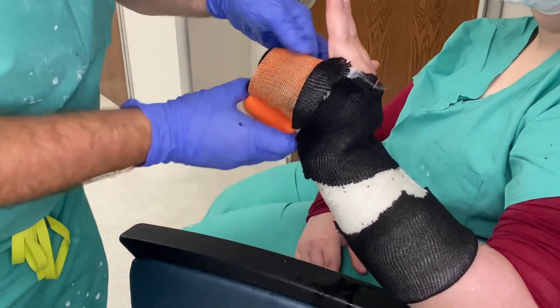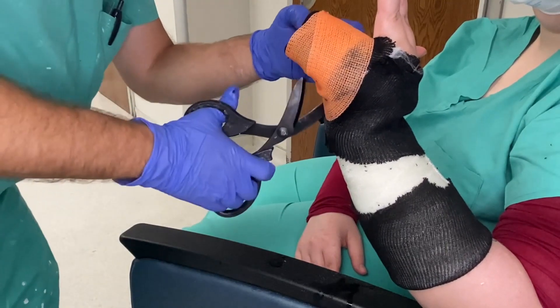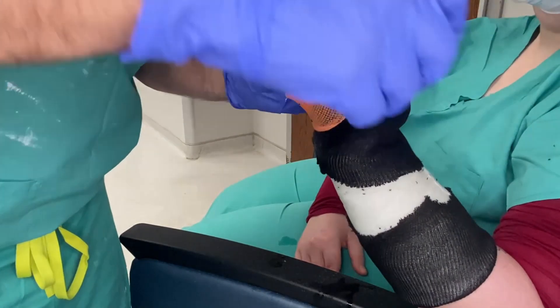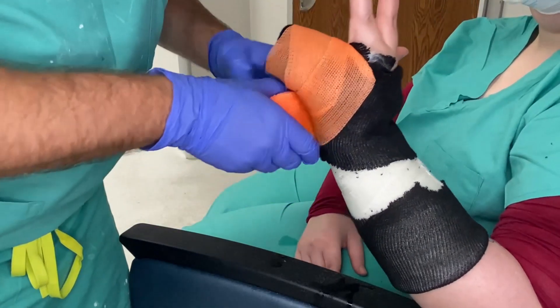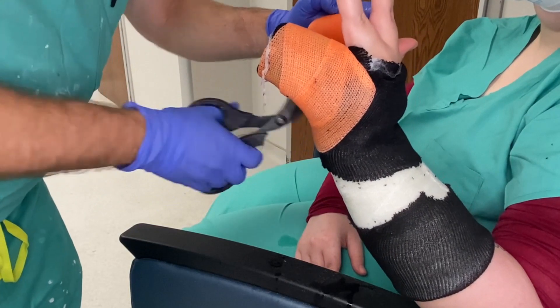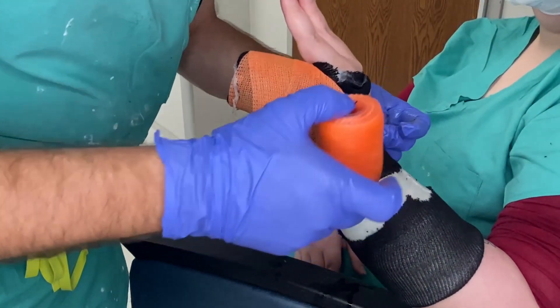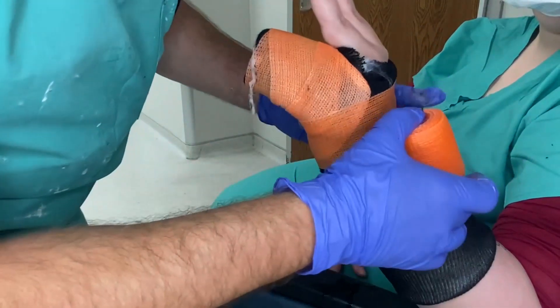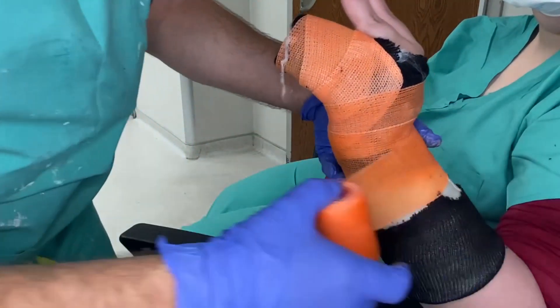Start the color fiberglass right at the base and work your way up 50-50 — one single layer is all you need. Do a corner fold and twist, making sure there are no sprigs or loose edges, because that will cut the patient's finger. Once you get around the knuckles, go around the thumb the same way — all the way to a half inch, corner fold, twist, return, corner fold, and capture it. Then go straight to the base of the thumb keeping it nice and free. Continue 50-50.